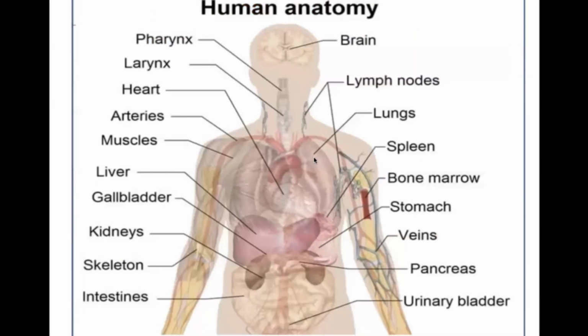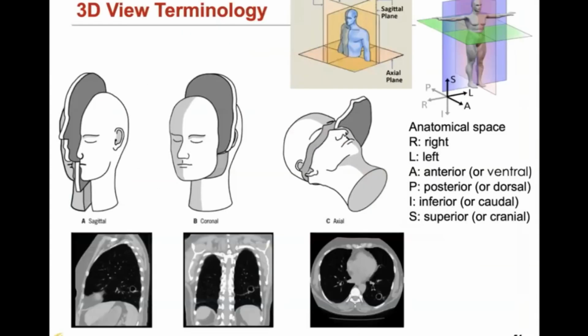And for you guys, most of us maybe don't have any medical background, right? So here I provide a human anatomy, right? Because we're going to look at the CT example, which is for kidney tumor segmentation. So basically we'll have this abdominal CT image, right? You have to have a good idea which part is kidney, right? And which part is maybe liver, right? So we have these two kidneys, and we have lungs, etc. Okay, if you're not familiar, this is maybe a reference image you can first look at. Once you understand these different views, we can see this in the next demo.